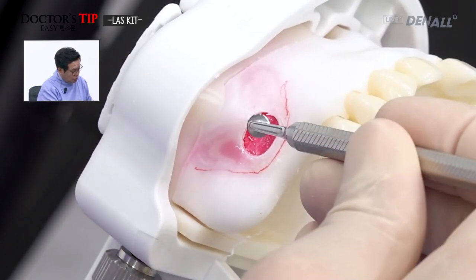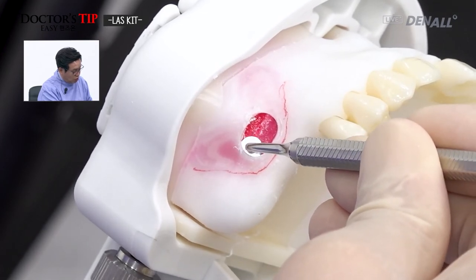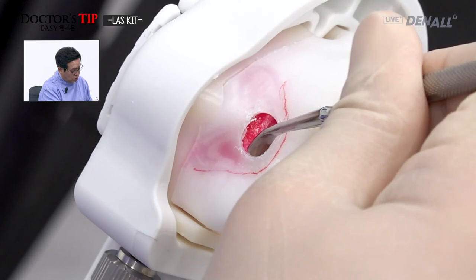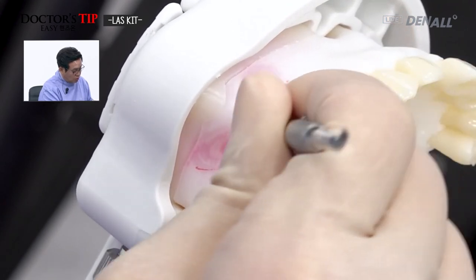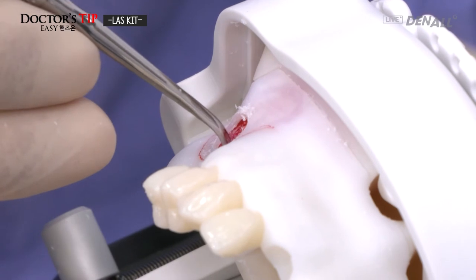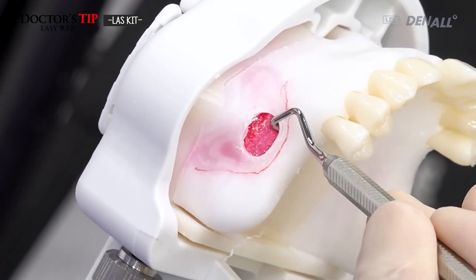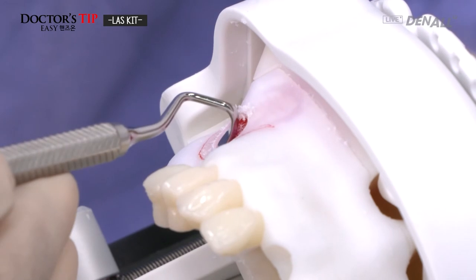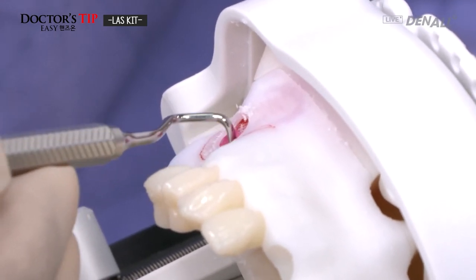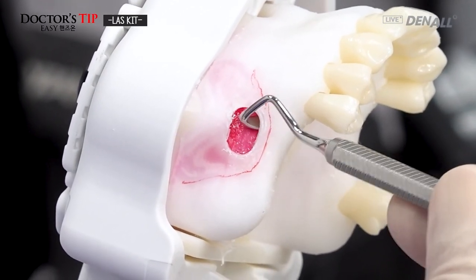Once the window is formed, first, using the separator, you do the initial detachment from the sinus membrane, and using the free elevator like this, on the distal side and also the mesial side, also the front side, the sinus floor side, and even the inner side, you detach fully. Or using the sinus curette, you can elevate the front part, or the opposite side, the back side. You first use the short shaft for this part, and then with the longer one, you can go even deeper.